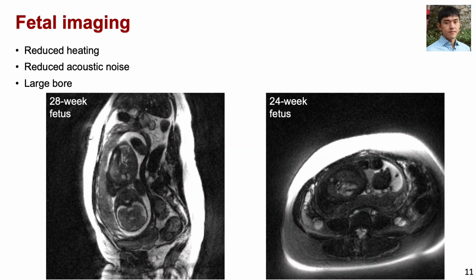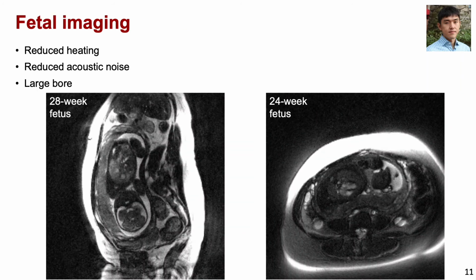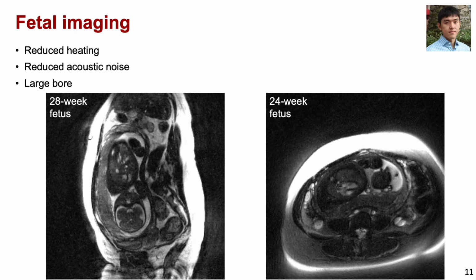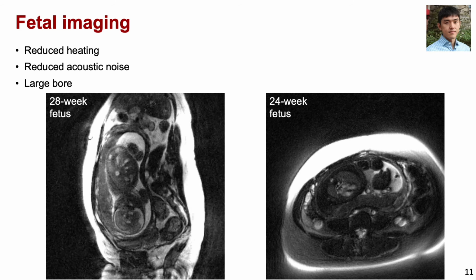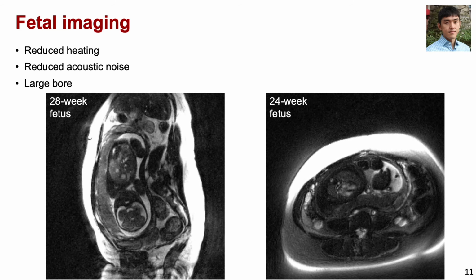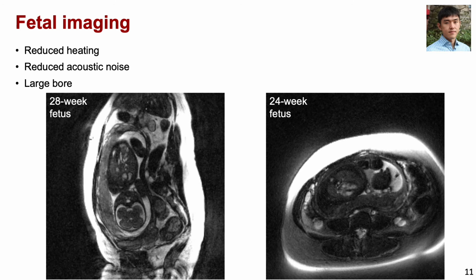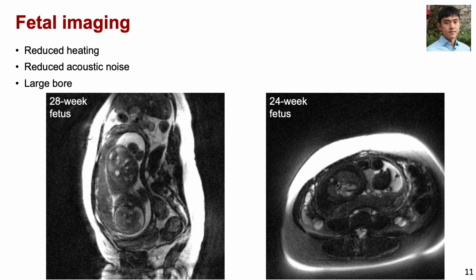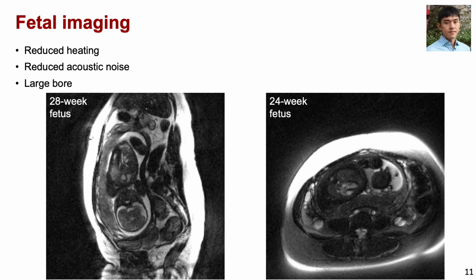So another possibility we are exploring is fetal imaging. Because of the greatly reduced heating issues, this is considered to be safer for unborn babies. And also because of the reduced acoustic noise, the fetus can stay relatively still during the entire scan.